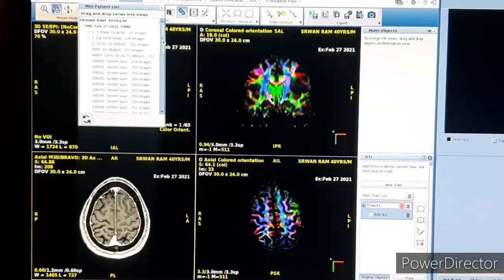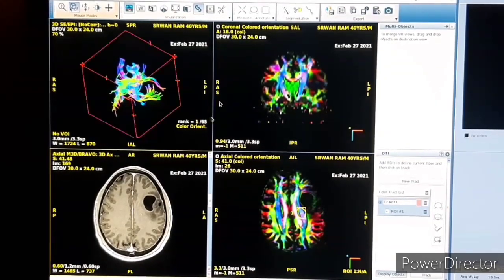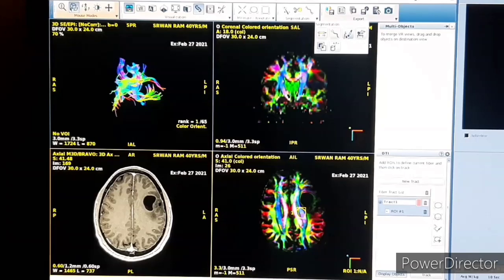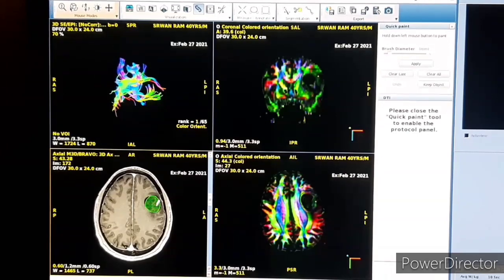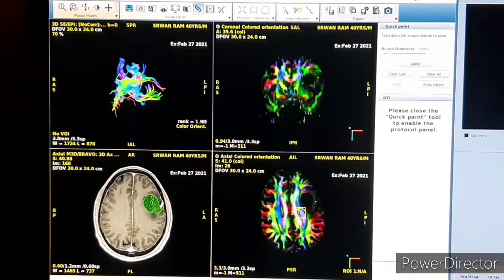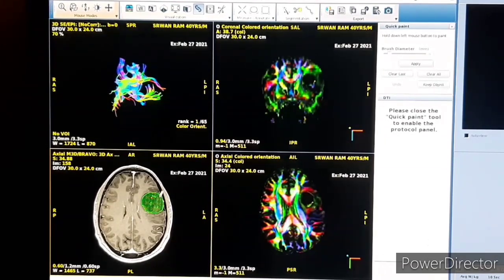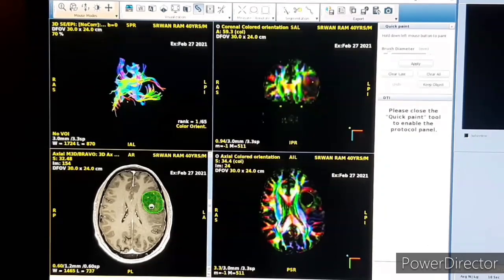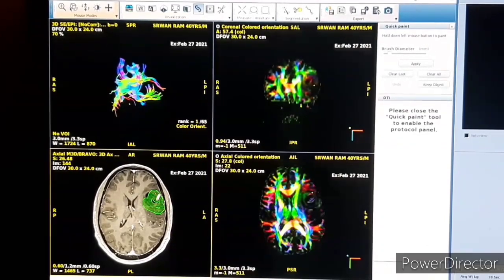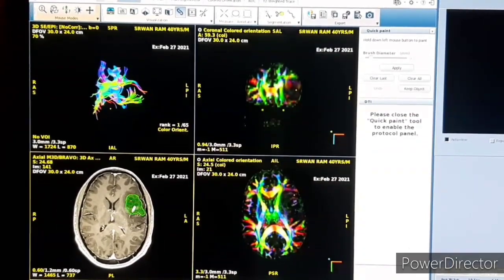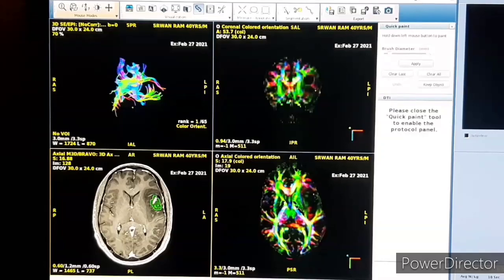Now we will go to the Quick Paint option. This Quick Paint option will trace the tumor area. You can see this is the Quick Paint area which traces the tumor — how many volumes of the tumor we trace using Quick Paint. You can see in the video I am tracing the tumor volumes.